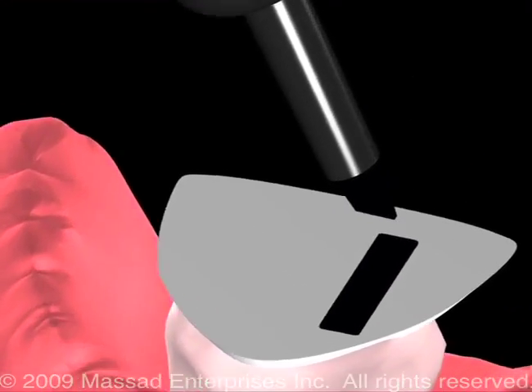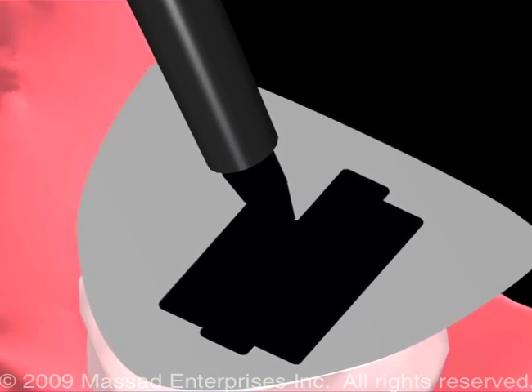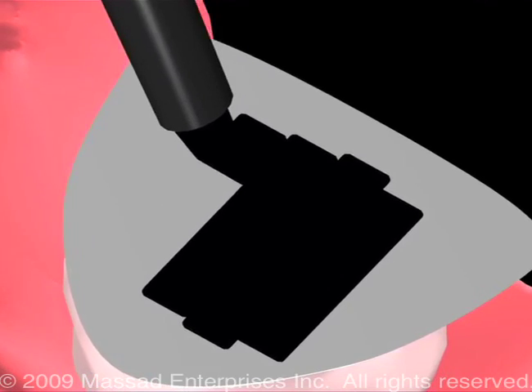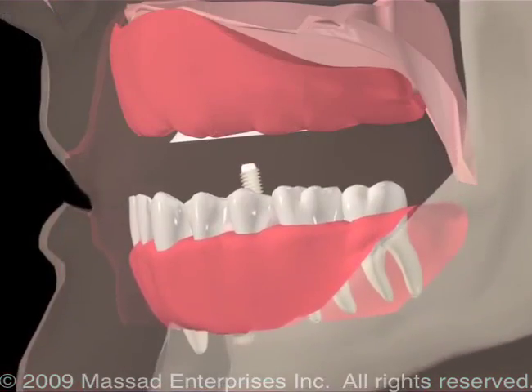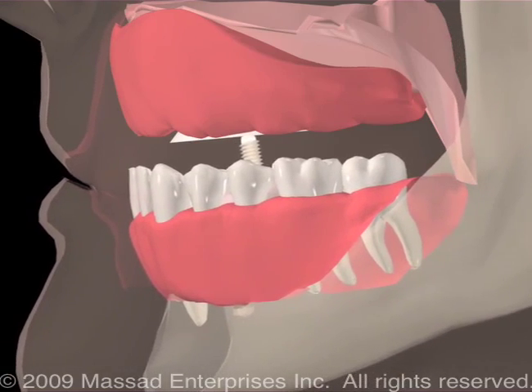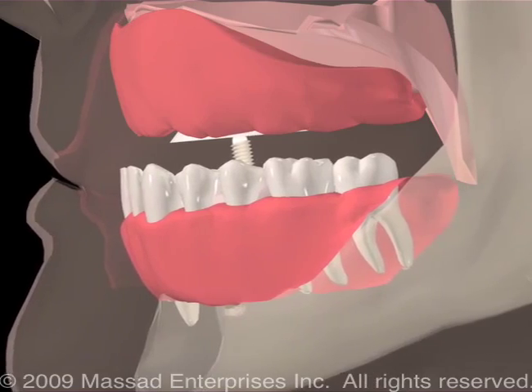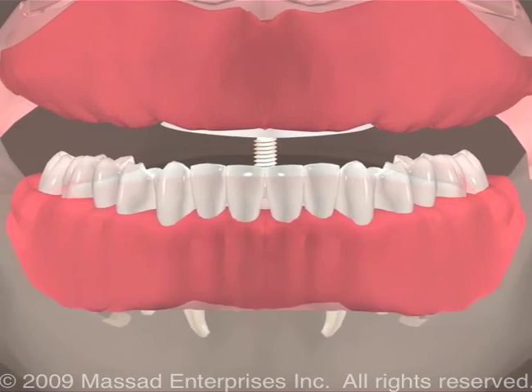Now place an inking solution on the maxillary striking plate. This will allow the practitioner to be able to see markings on the striking plate when the patient slides forward and back and side to side, and then read the tracing marks. The patient is asked to tap to assure that the bases are completely seated, and then to slide forward and back, and then to repeat forward and back, and then side to side.